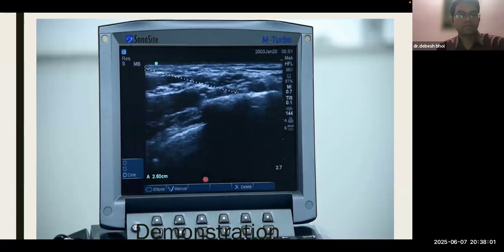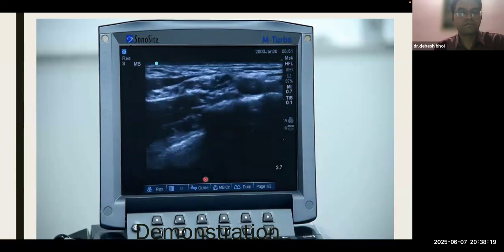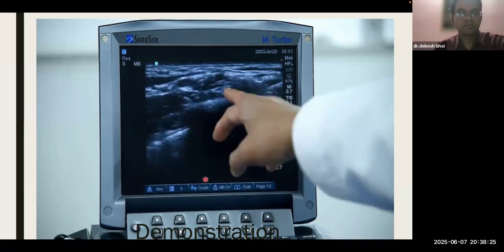First injection normally we do at this level, so that you can give around 8 to 10 ml here, so that the inferior trunk will not be missed. That is normally hidden like this. Again, you come back and deposit the drug in the intracluster or above that, so that all the plexus will be protected with the local anesthetic. This is one thing. Okay. So if you go up, suppose you want to do interscalene block, then you will go a little more upward.